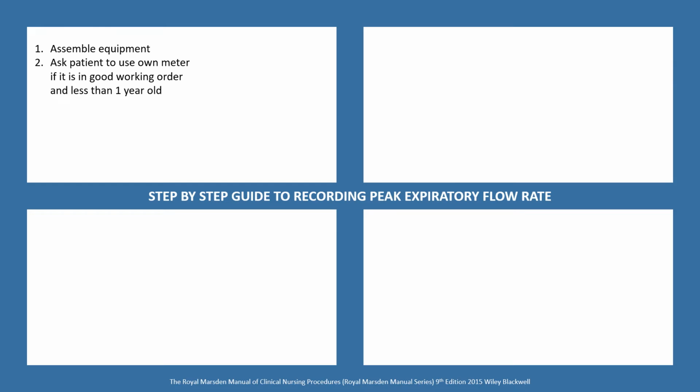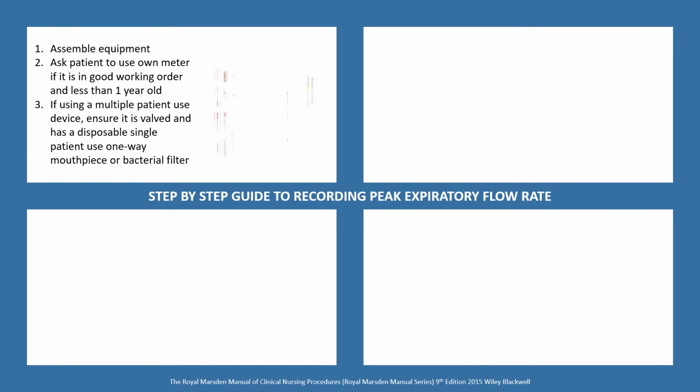First bit is all about assembly of equipment. Make sure if you're doing this within a surgery, if your patient can bring their own meter in, that's fabulous, but it does need to be in good working order and it needs to be less than a year old.